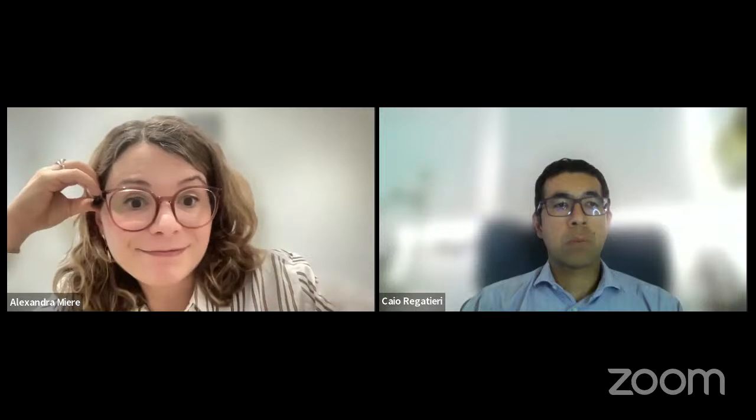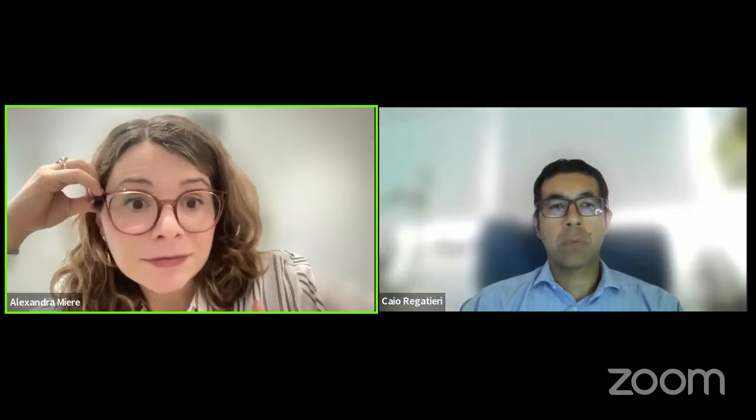What's your experience? Yeah, I think the same. I was asking because probably if there is a great amount of hyperreflective foci, the probability to develop macular atrophy is greater than if you have just 1 or 2 hyperreflective foci in that area. But I don't know, I didn't search the literature. This is a very interesting study idea, actually.